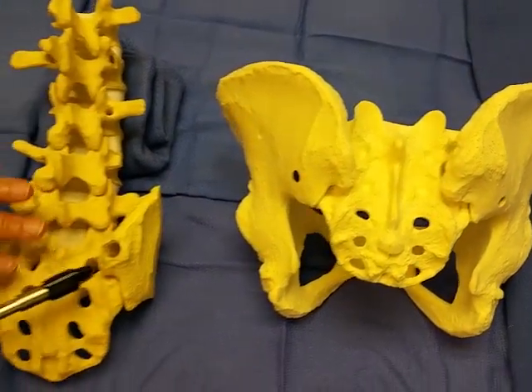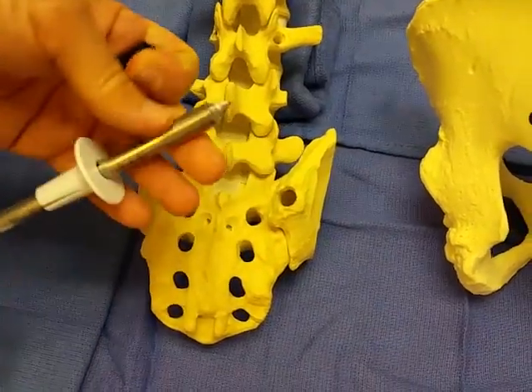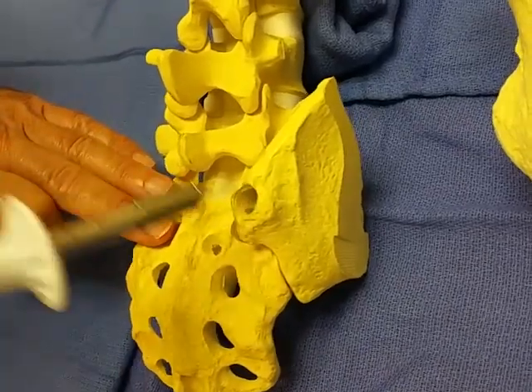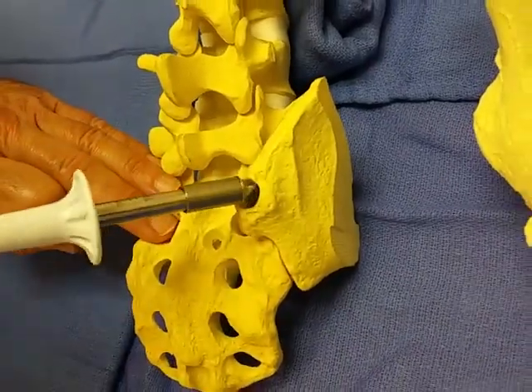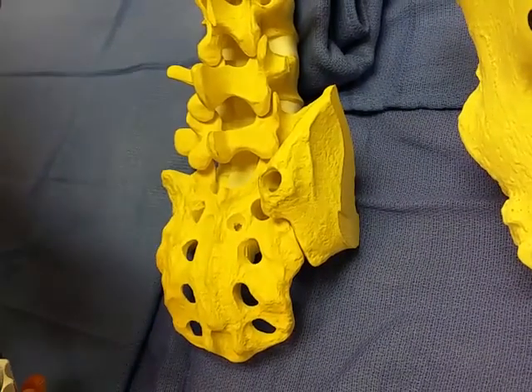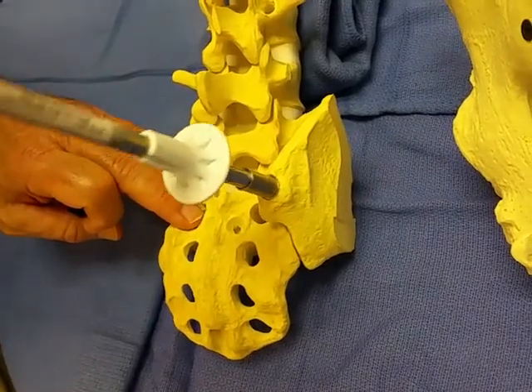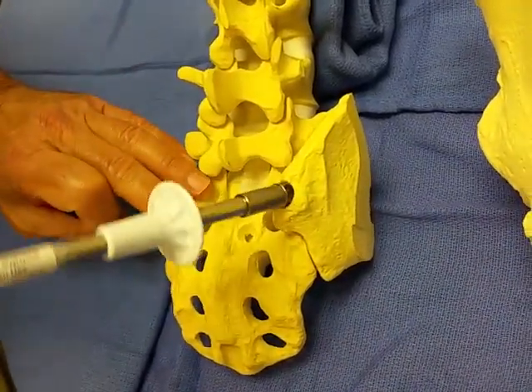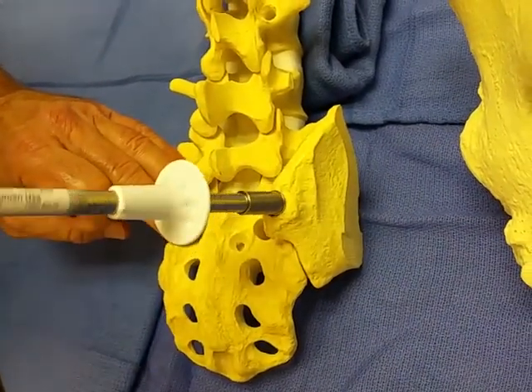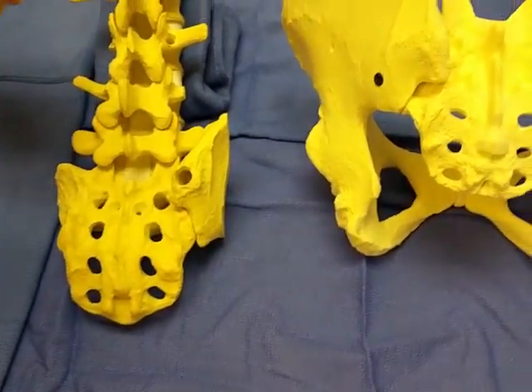In this model over here, we show that we have created, with the use of the Corex trocar fine, a cortical defect. This is a little bit larger than the trocar fine we're showing here, which is our smaller version. This can be enlarged once you reach the shoulder surface of the trocar fine by just wobbling the trocar tip as you rotate it while you're in the posterior superior iliac spine.